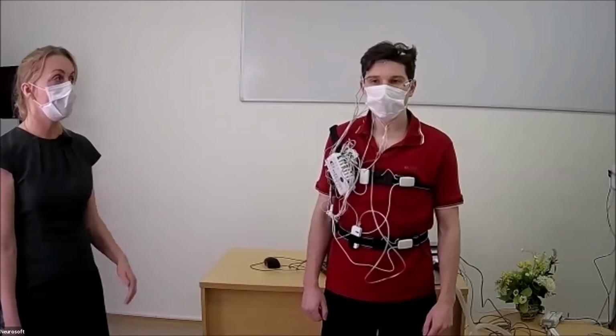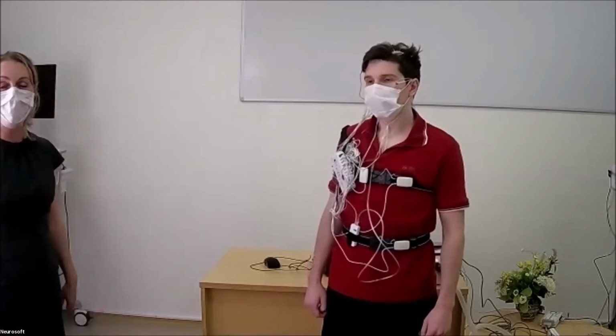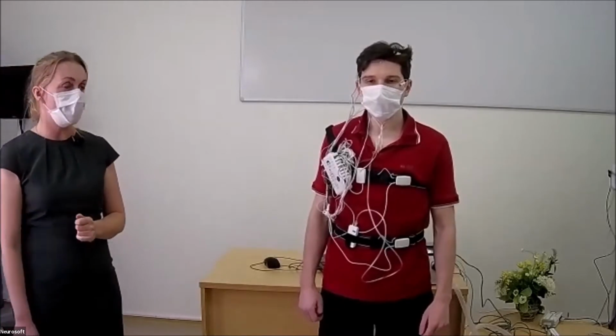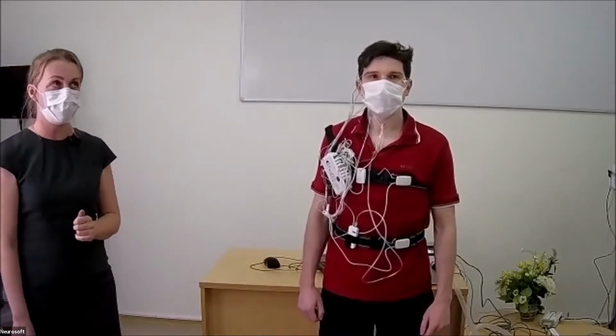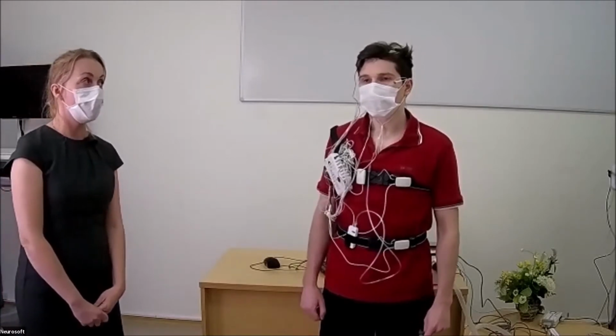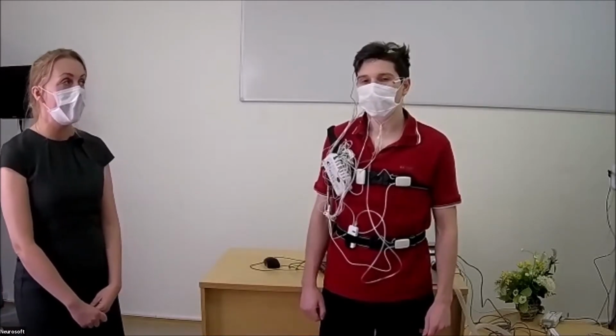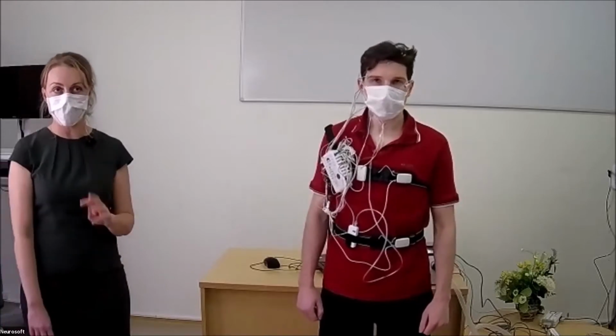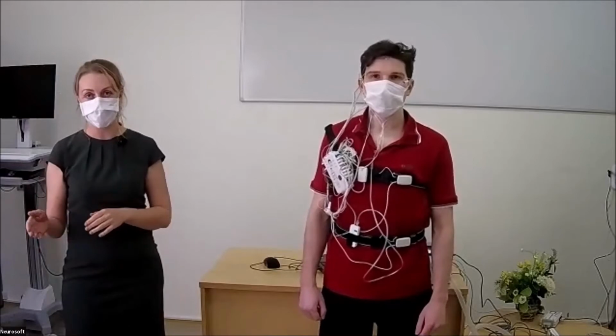We need 3 EEG channels: F4M1, C4M1, O2M1. So these 3 derivations are enough for sleep staging.